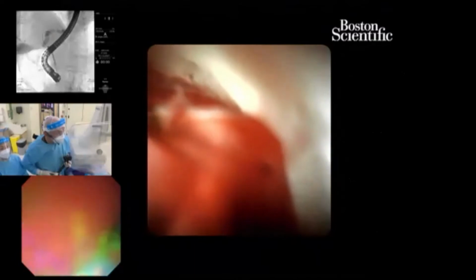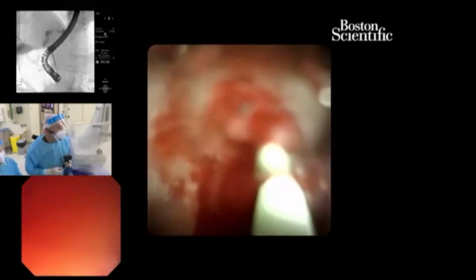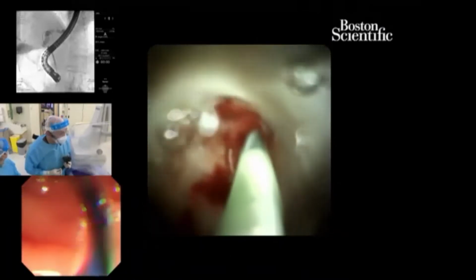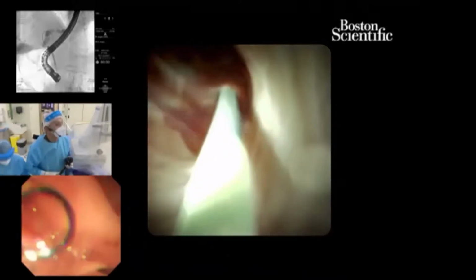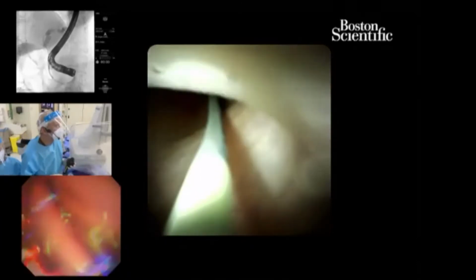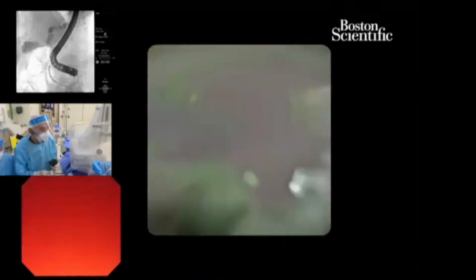Okay, do we have suction? So I don't see an obvious tumor right now. Okay, can we turn off suction? Seems like the blood clot is being washed away. There seems to be a smooth stricture. What do you guys think? If you're in good position, maybe if you remove your guidewire, it will be better to wash and all this stuff. Yeah, well, I can remove my wire, but you can see my spyglass, I'm really losing position. So what I think I need to do is to recannulate and then reinsert the spyglass.